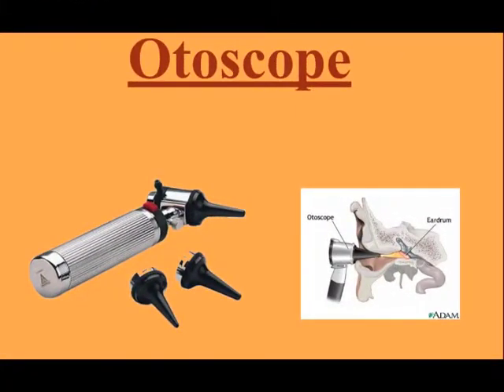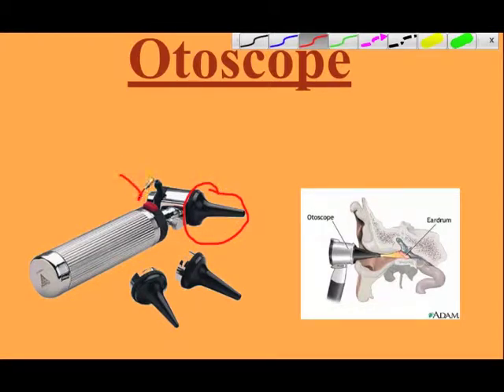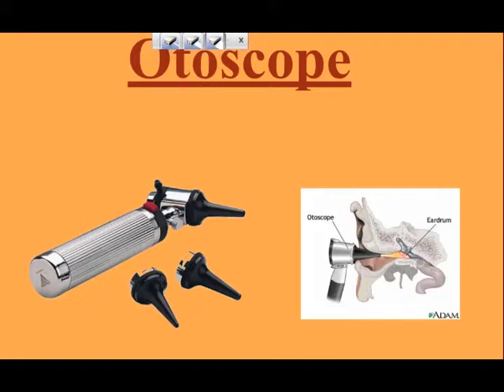Okay, and now the next thing we're going to look at is something called the otoscope. The otoscope is a great, great tool from the doctor's office. Looks kind of scary, looks a little goofy too. You see all these pointing edges and things like that. But what happens is the doctor's going to stick this part right here inside your ear. And then they're going to look through this section in here to make sure that everything inside your ear is working the right way. Okay, they're going to look in there to make sure everything looks normal, make sure that there's no fluid or anything in there that could cause problems with your hearing. It is an excellent, excellent tool.